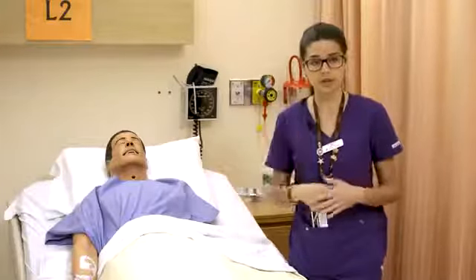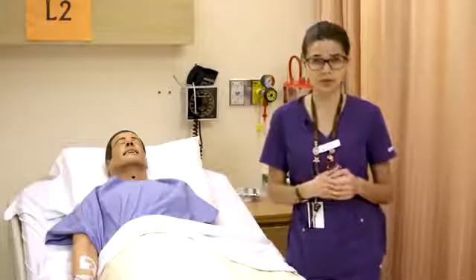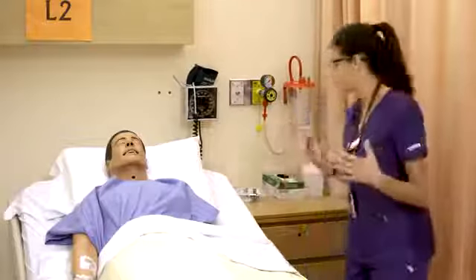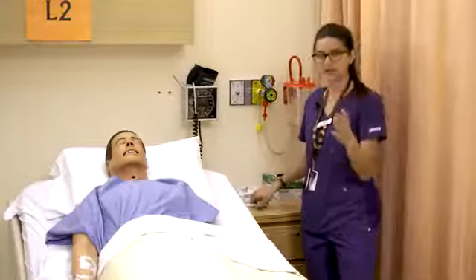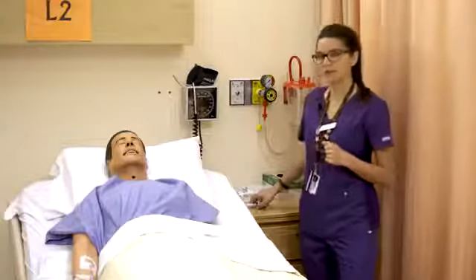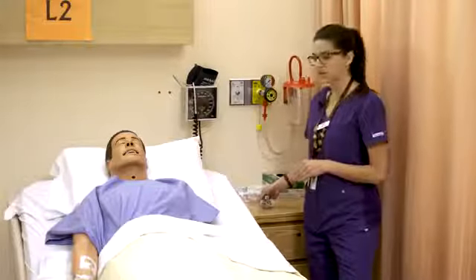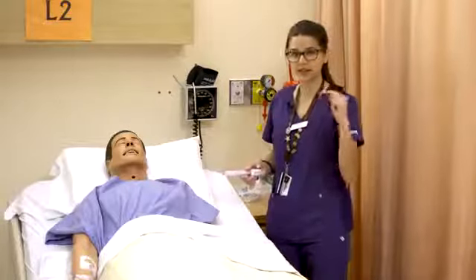So what we're breathing in without added or supplemented oxygen is about 21% O2. Keeping that in mind, we're going to go through some different delivery systems and list the FiO2 with them.